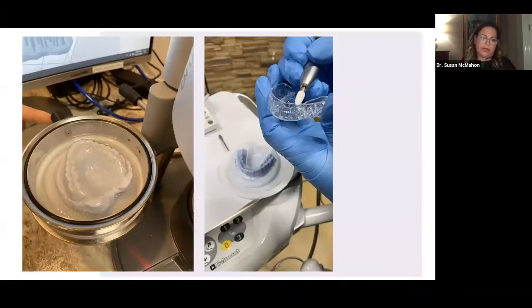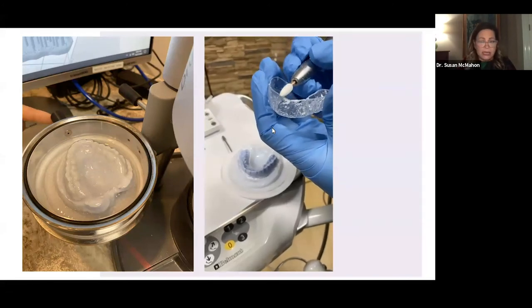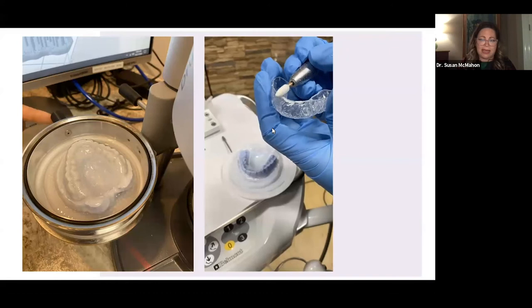Old school, we're gonna put it in that Drufomat, we're gonna vacuum form some material down on it, and then we've gotta cut it out, and the cut out part was the worst, right? And we do it on a slow speed handpiece with a nose cone, cut it out of the material, and then polish it up.